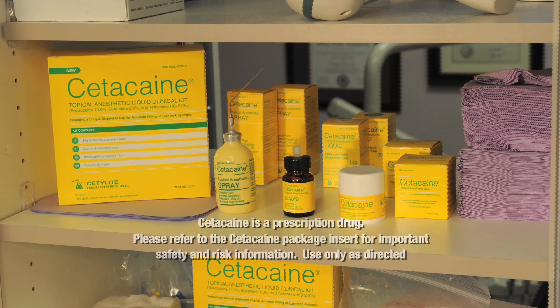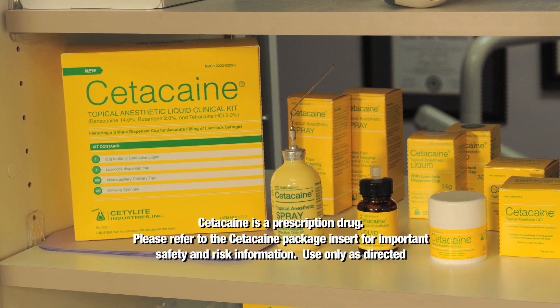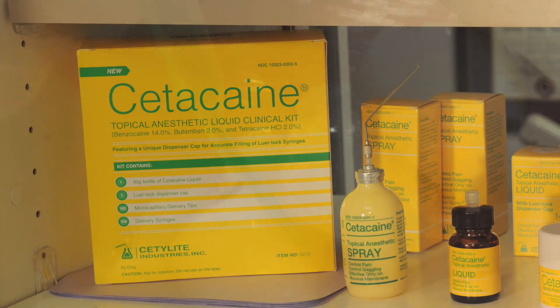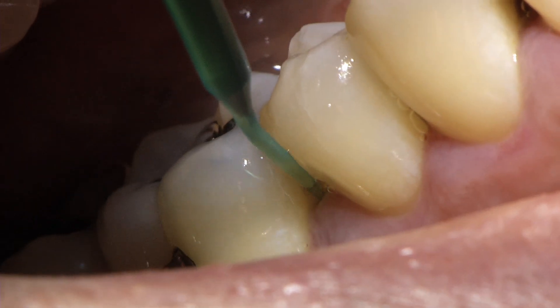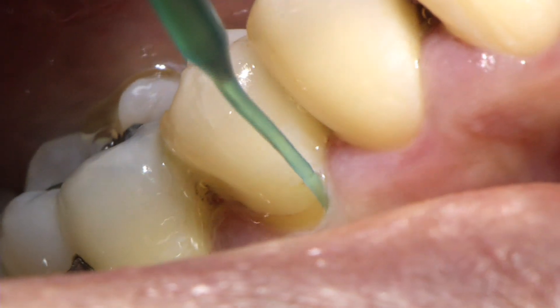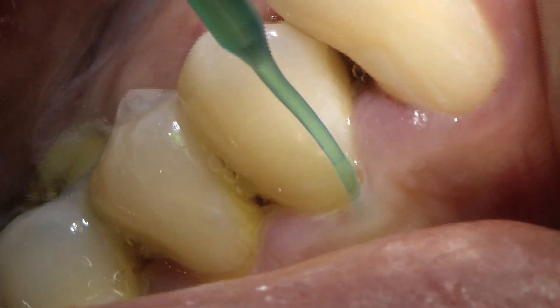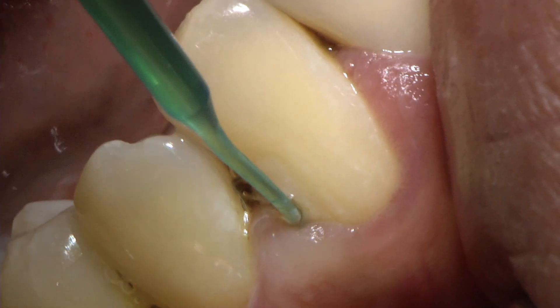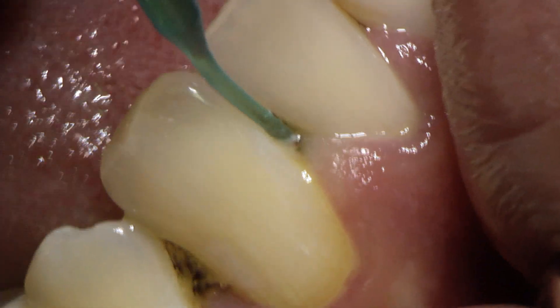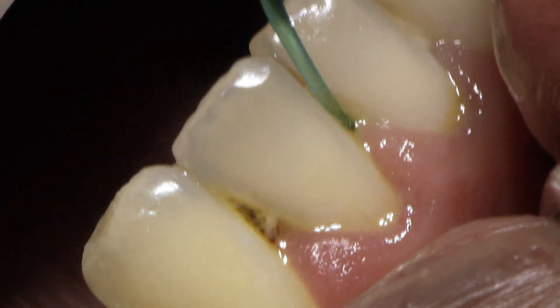The effectiveness of Cetacane liquid in anesthetizing soft tissue makes it an appropriate option to manage the discomfort associated with laser debridement therapy. To apply Cetacane liquid subgingivally, insert the microcapillary tip to the base of the pocket, slowly depressing the syringe plunger to dispense small amounts of liquid as you walk the syringe through the pocket. Because of the potency of the Cetacane liquid, it is not necessary to dispense excessive amounts to achieve the desired anesthetic effect.